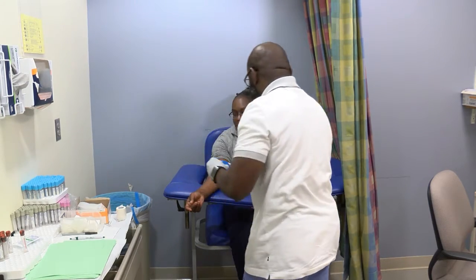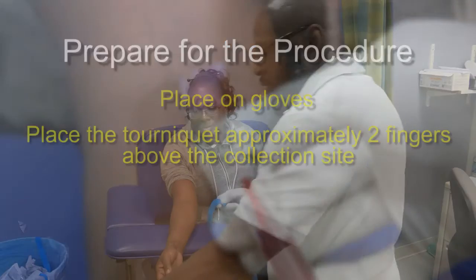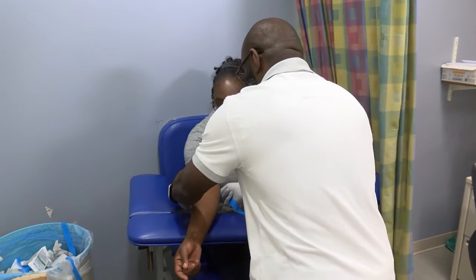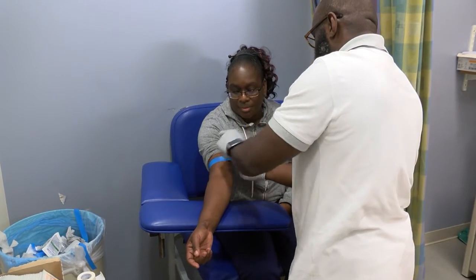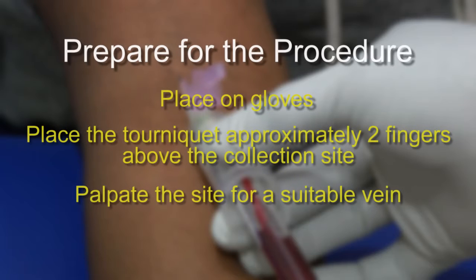I'm going to try the tourniquet. Now that you have properly identified the patient, place the tourniquet around the patient's arm, approximately 2 fingers from the collection site. Just going to take a quick look at your veins, okay? All right. It's not so tight, okay? Is it okay like this? Yeah, that's good. Begin palpating the site for a suitable vein.